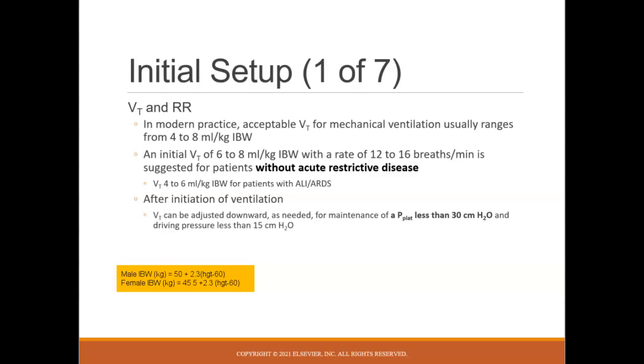After initiation of ventilation, you can adjust things down. So you're going to look at your tidal volume after you put the patient on it. And then I want to make sure that I'm maintaining that plateau pressure less than 30 and a driving pressure less than 15. So let's give a scenario here.